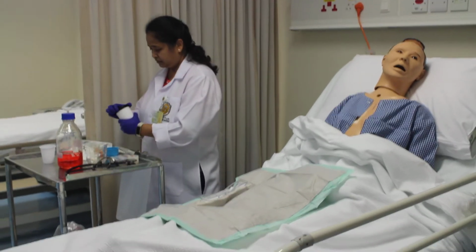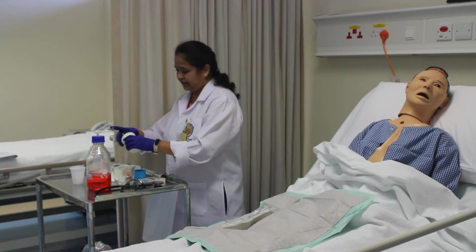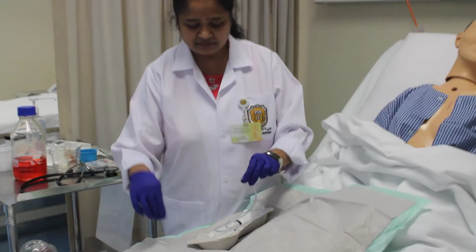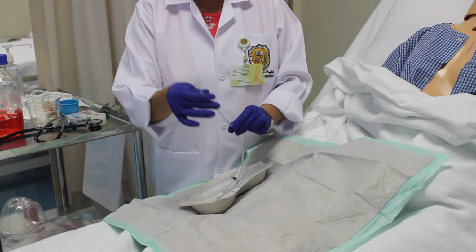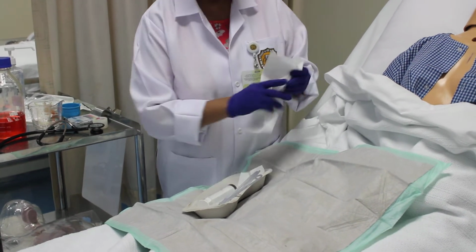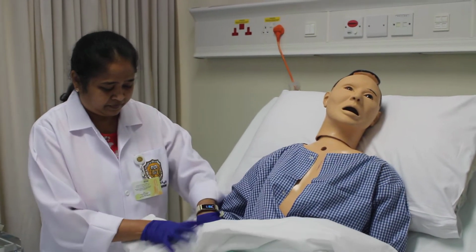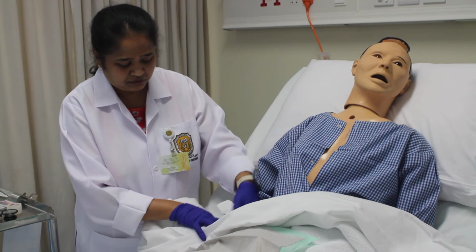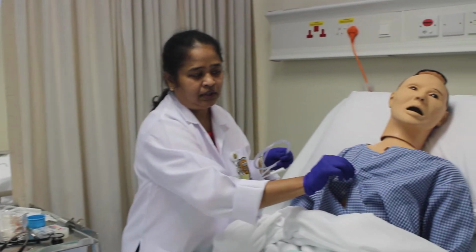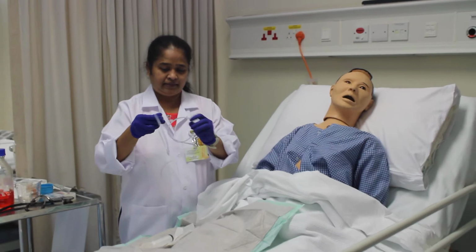You need to apply a little bit of Vaseline. Ideally it should be jelly which should be applied, but for the mannequins we don't have it, that's why we are applying this. Sir, you can have a tissue in your hand. If it is a real patient, you give a tissue and water also, so that in between when we are asking him to swallow, he can swallow it. Shall we go ahead with the procedure, sir? Are you okay? Okay.